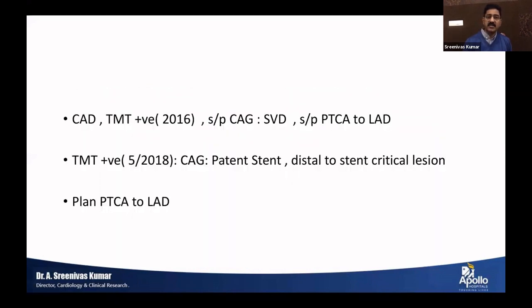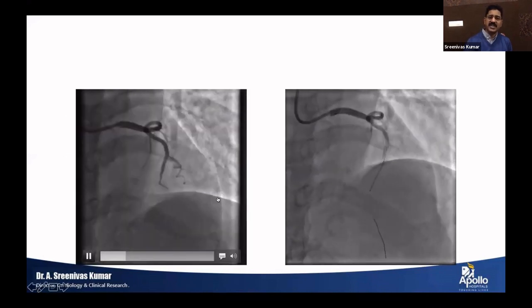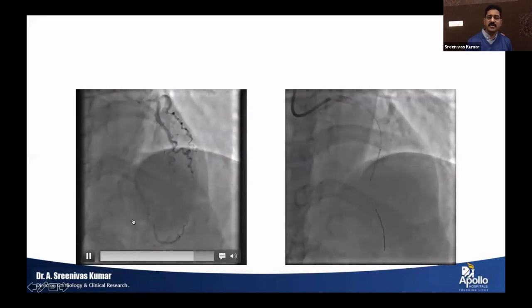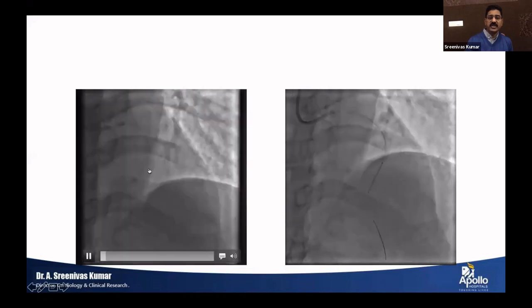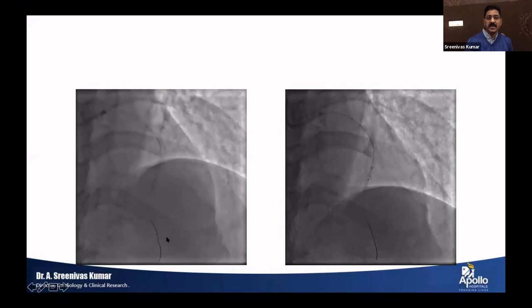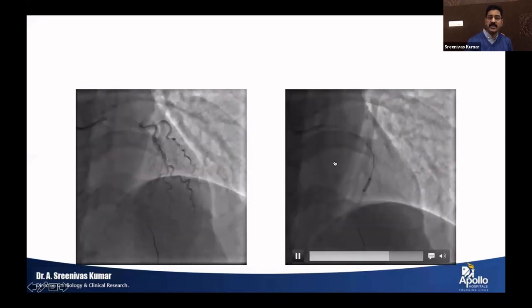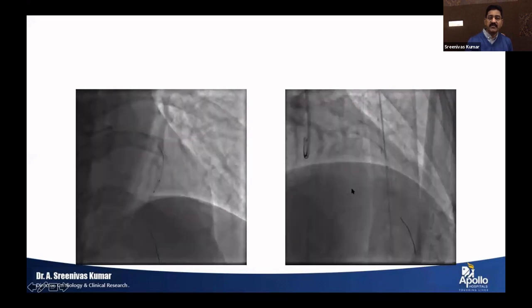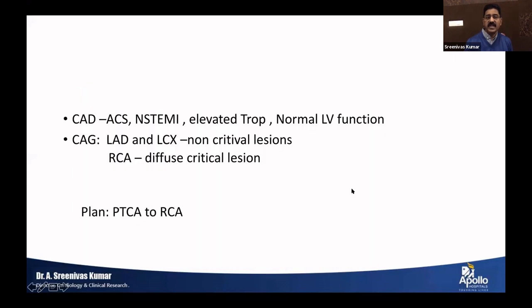Another patient came after LAD stenting before, and distal to it, you have tight stenosis. Many of the times we leave it, but this patient had ongoing angina and was requesting something to be done. We were not sure whether we could tackle it effectively, because distally again, it could dissect and lead into trouble. With the availability of these thinner struts, we did it, but again, the segment proximal to it did not expand well. We had to take the help of NC balloons and dilate it again within the stent, and finally the patient did fine.